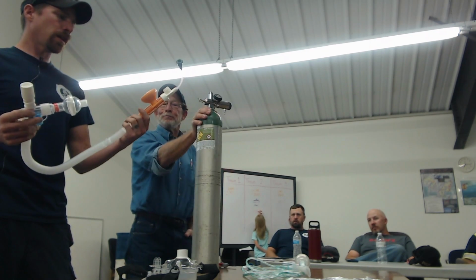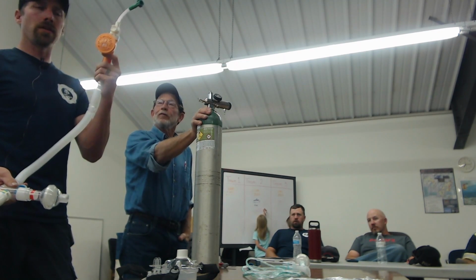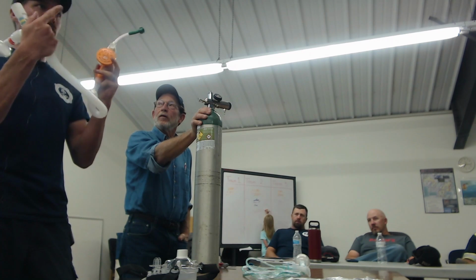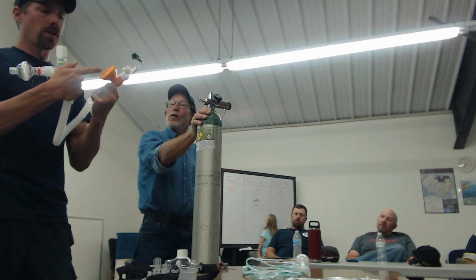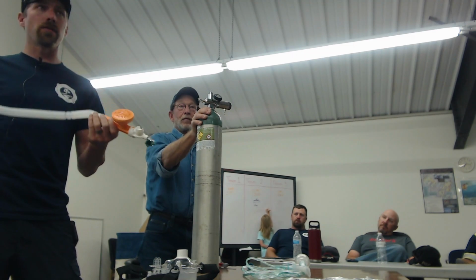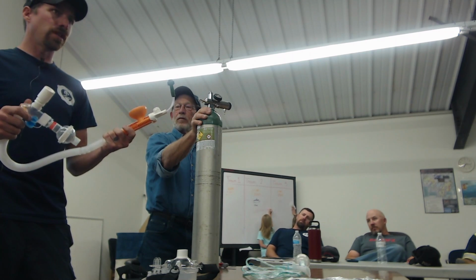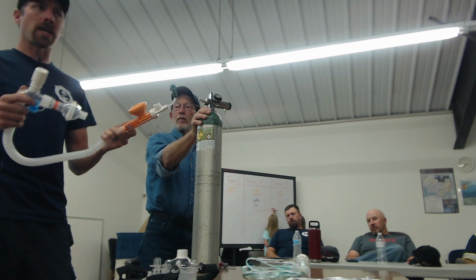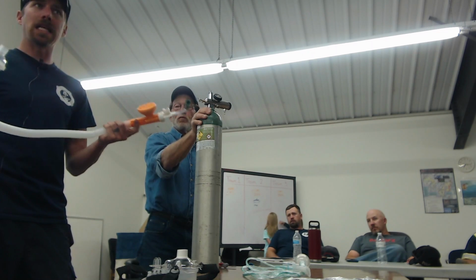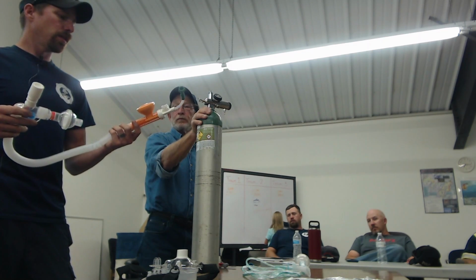A unique feature of this particular brand is that the intake for the room, the atmospheric air, is also a HEPA filter. So if you have a patient that's obviously already in respiratory distress and nearing failure, you don't want to introduce any other contaminants or allergens or anything like that. So that is an advantage that you are giving the patient clean air, 100%.